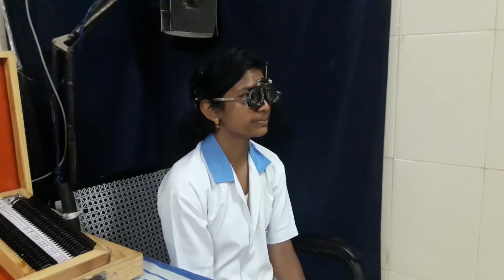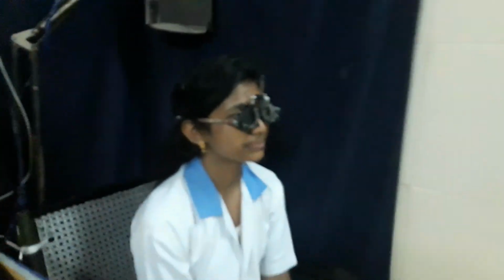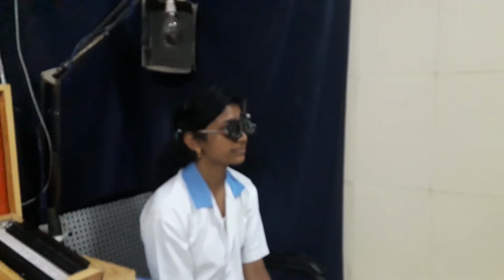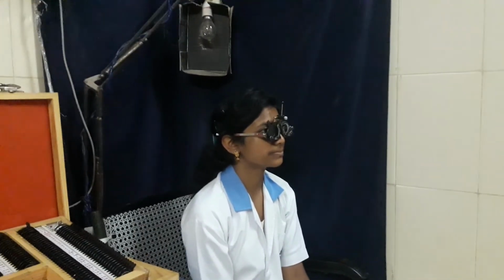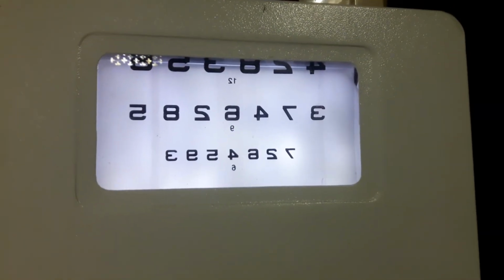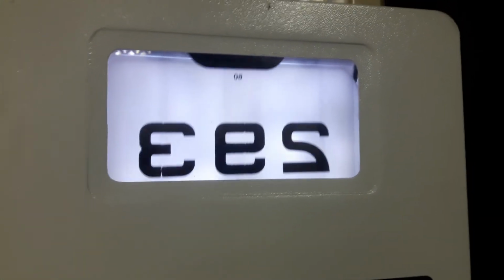After the recording is done for the right eye, the occluder is now shifted to the right eye, and the recording of vision starts again from asking the patient to read the distant Snellen chart. And if the patient is able to read until the last line, the vision is taken as 6 by 6. The vision recording goes on with 6 by 6, 6 by 9, 6 by 12, 6 by 18, 6 by 24, 6 by 36, and 6 by 60 according to the patient's vision.